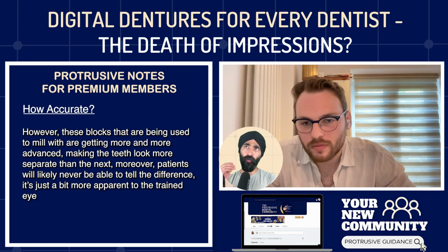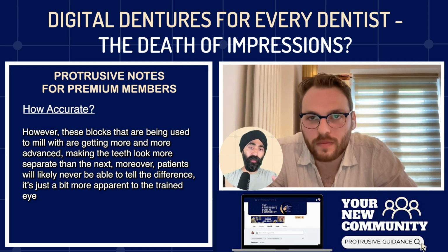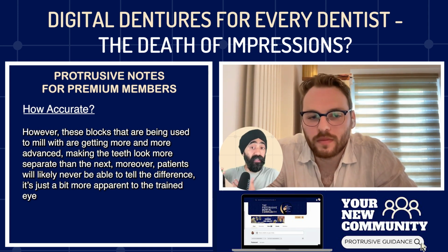What kind of metrics were you assessing for in terms of patient feedback, and also your feedback? Like, for example, yes, the patient preferred them, but did you notice a difference in the retention and stability, or is that roughly the same? It's just the patient preferred the comfort. Was it superior, and was there anything that was inferior about the digital compared to the traditional?